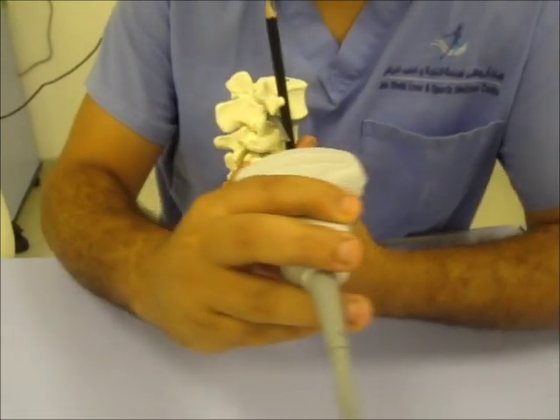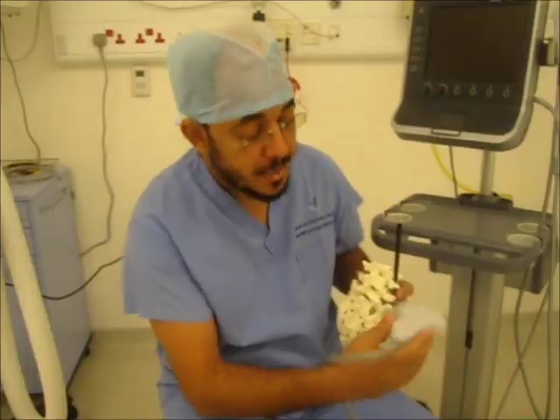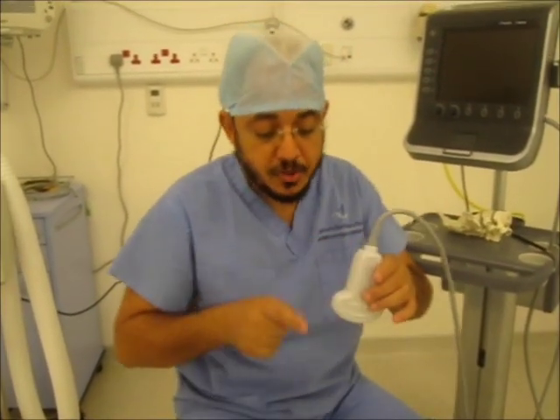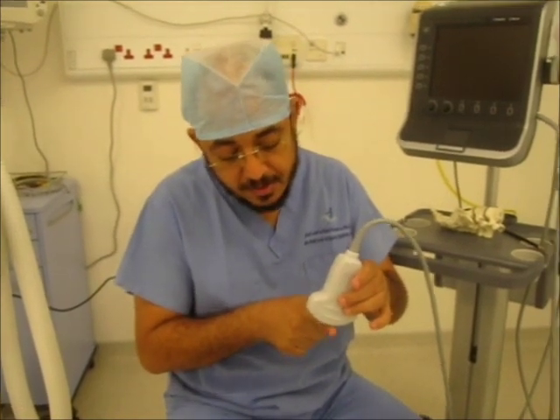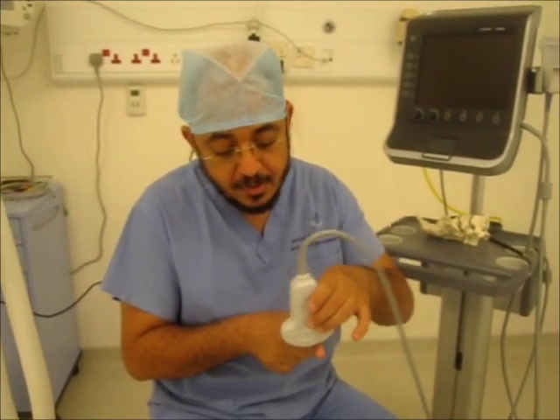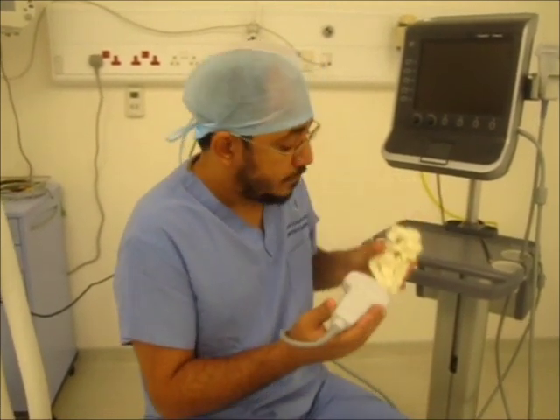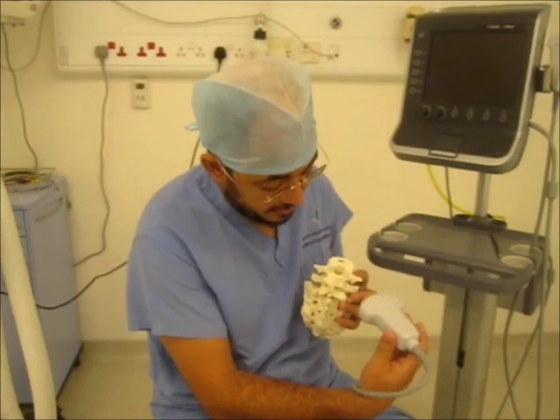In this view, you will see it like this — the posterolateral view. The rocking movement is the movement of the ultrasound probe across the short axis. This is the short axis. If you do like this, this is called rocking movement. So what we will do? We will go lateral, then rock it medially.